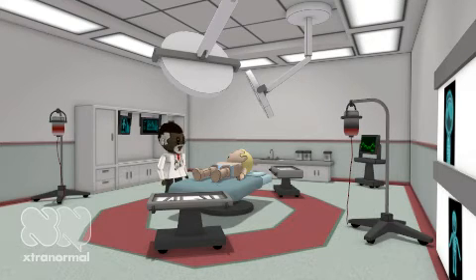In SIMV, the characteristics of the mechanical breaths are identical to those in assisted ventilation. As a result of a pressure-supported breath, the spontaneous volume will increase. The patient is now initiating only one breath between two mechanical cycles.